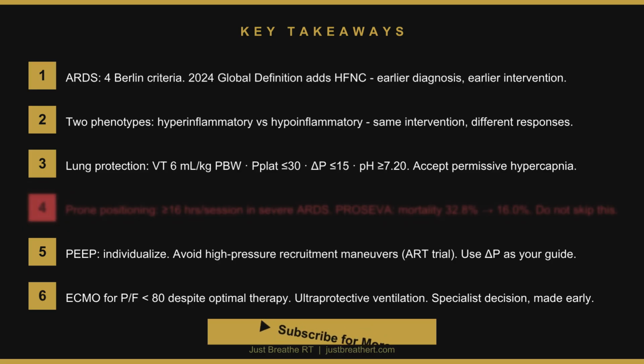Prone positioning for severe ARDS, 16+ hours per session, early, consistently. The PROSEVA survival benefit is one of the strongest in critical care medicine. PEEP, individualize. Avoid high-pressure recruitment maneuvers. Use driving pressure as your guide.